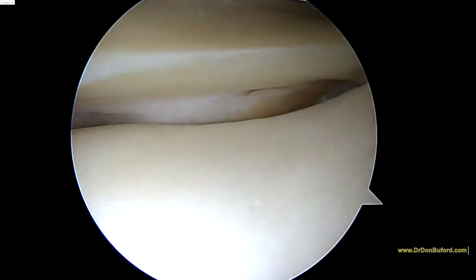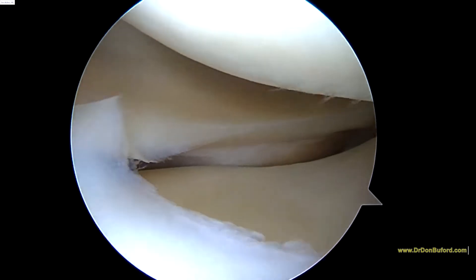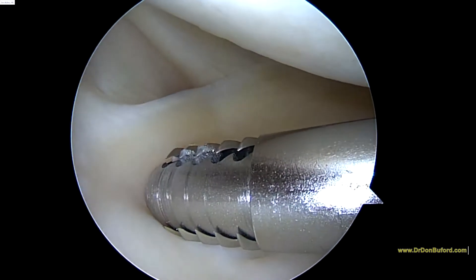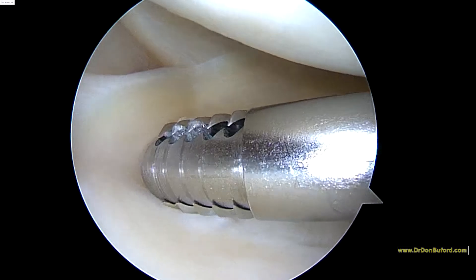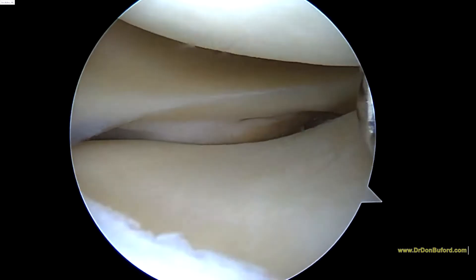This is the lateral compartment. It's checking out pretty good. There's the posterior horn of the lateral meniscus as you come around here. You can see the popliteus tendon going up towards 11 o'clock on the screen. The rest of this meniscus is in pretty good shape.